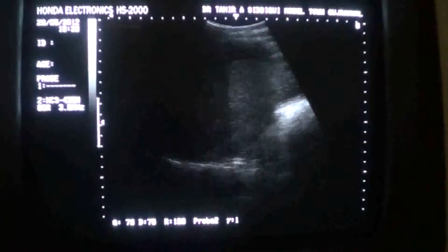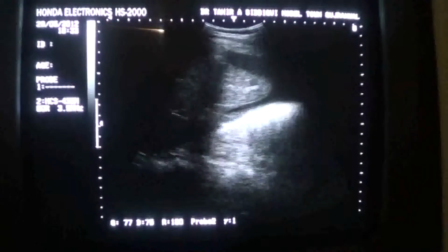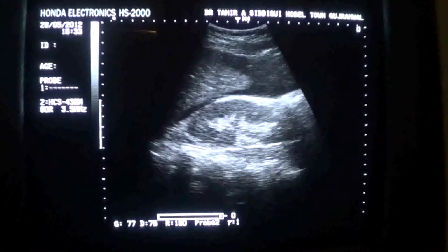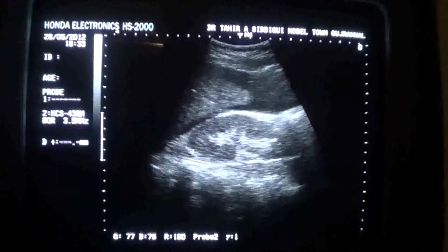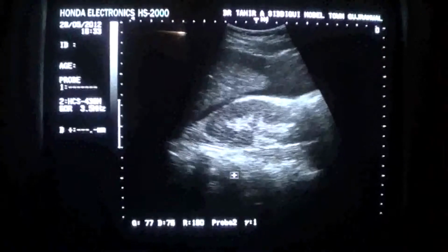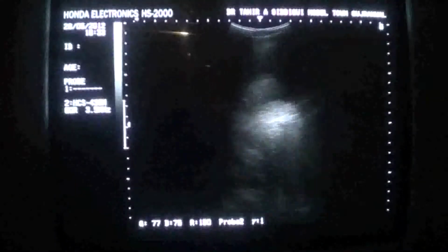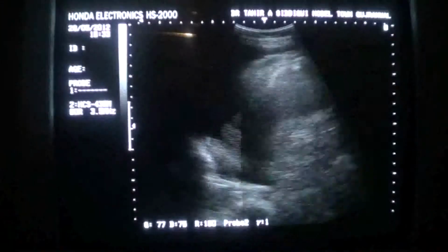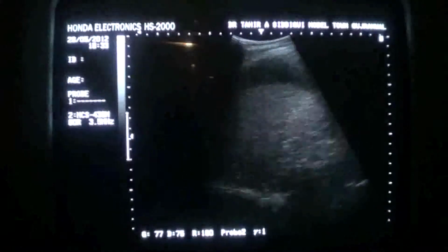The kidney. This is the right kidney, in longitudinal section. This is normal. Capsule is intact, no internal injury seen. So now this is fluid, straight away just below the costal margin, and the bowels are floating in this fluid. These are the bowels that are floating in it.